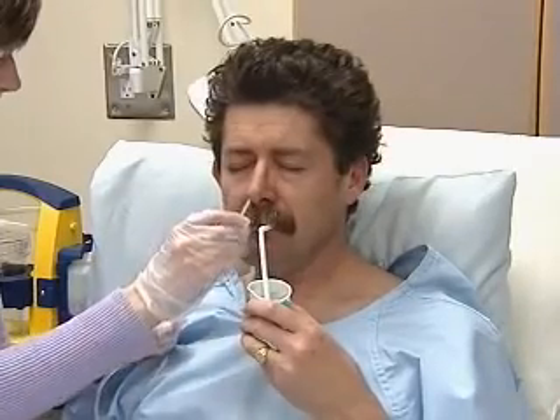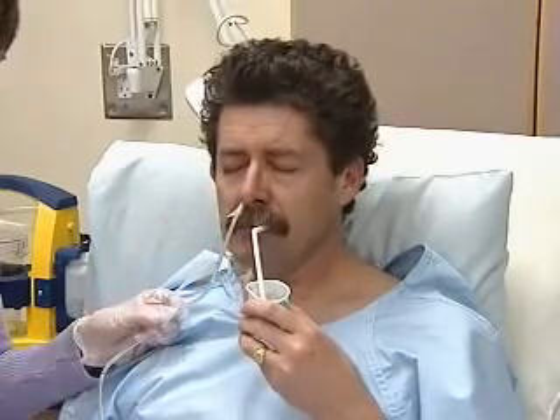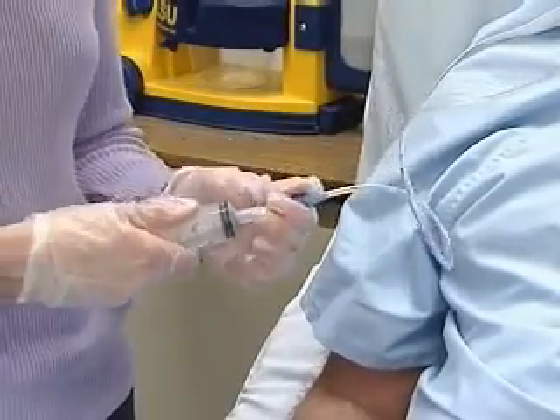Advance to the measured mark and anchor the tube to the cheek while you make sure the tube is properly positioned. Your patient should be able to speak. You'll attach the distal end of the tube to the syringe.